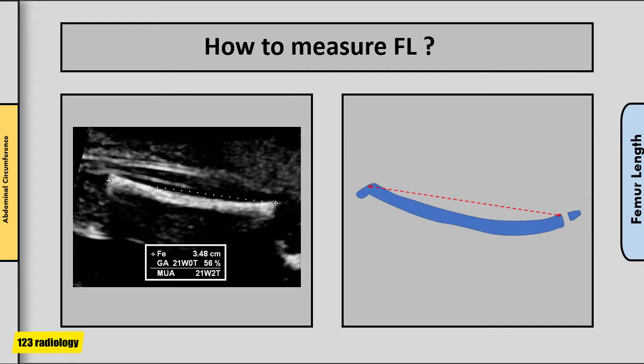To measure femur length, obtain a longitudinal view of the femur closest to the probe. The endpoints are easiest to define when the femur lies at a slight angle of 5 to 15 degrees to the horizontal. The full length of the bone should be visualized and not obscured by shadowing from adjacent bony parts. Magnify the image so the femur fills at least 30% of the monitor. Place the intersection of the calipers on the outer borders of the femur bone, outer to outer. The greater trochanter should not be measured.